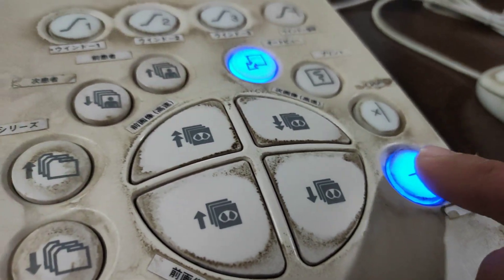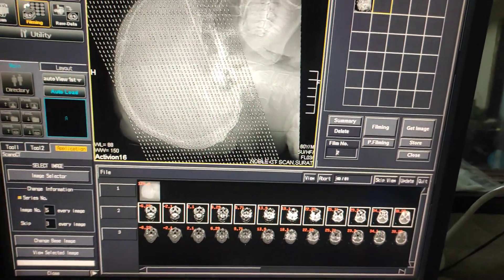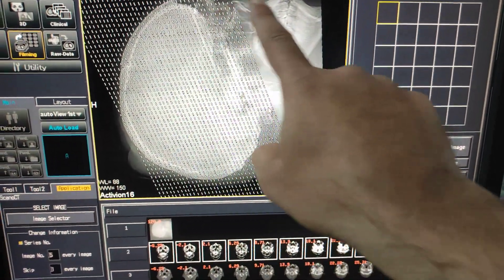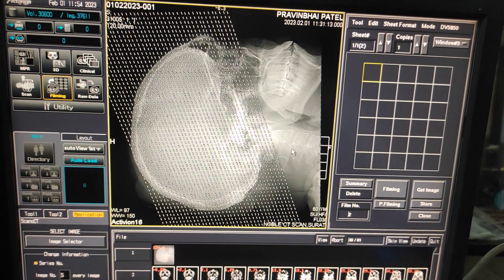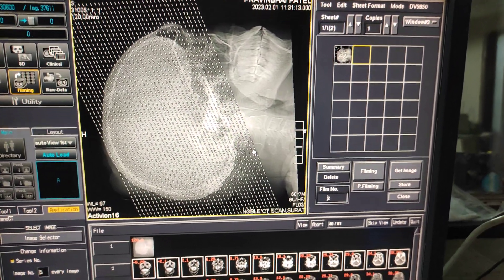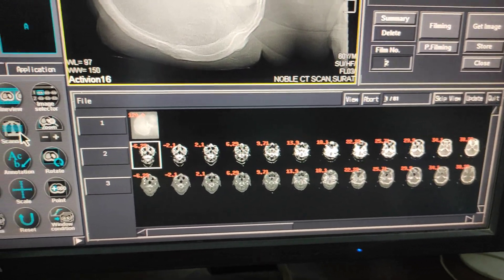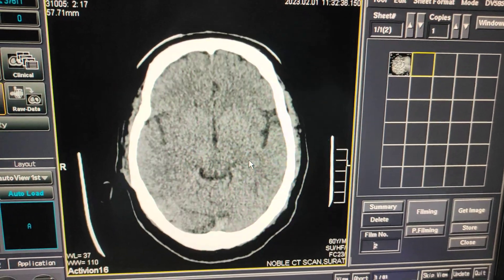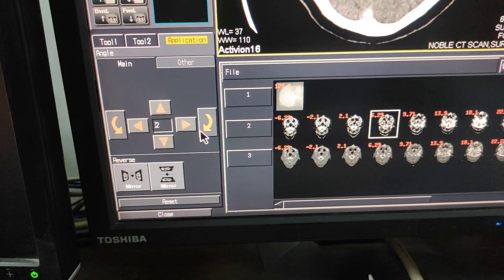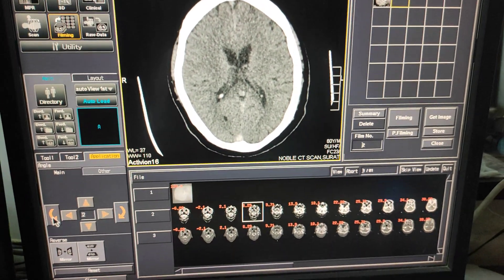From here you can enter the images. You have to zoom the image according to this box — this much zoom is enough. Enter the first image. Now the scan is over. Select the first image, then close these lines. If the images are tilted, you have to angulate properly — from the rotate option you can angulate the image to a straight, proper orientation.